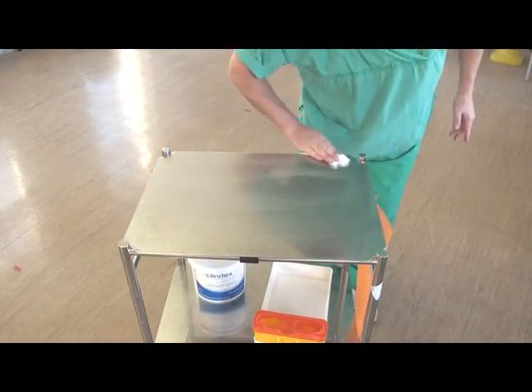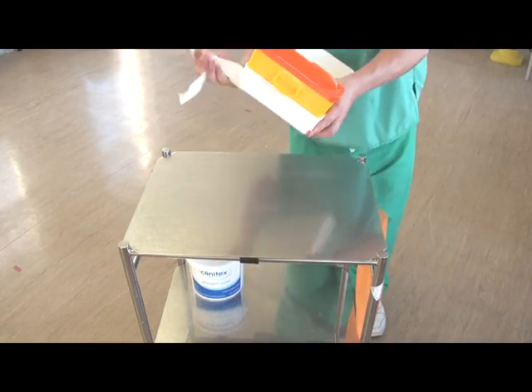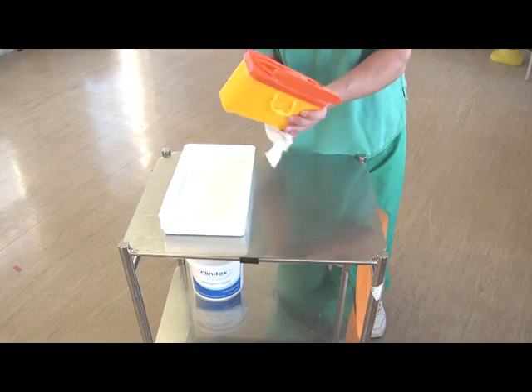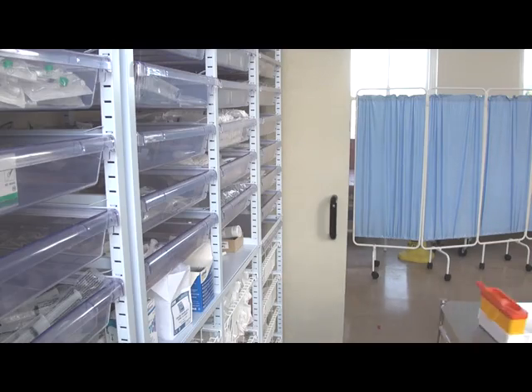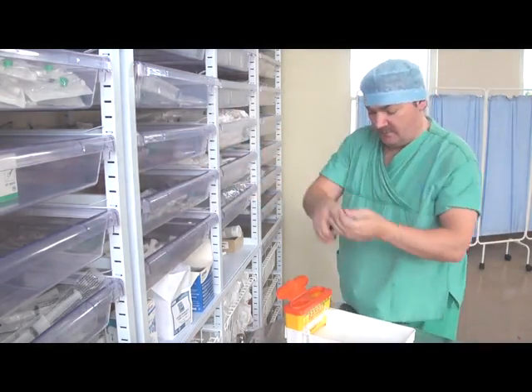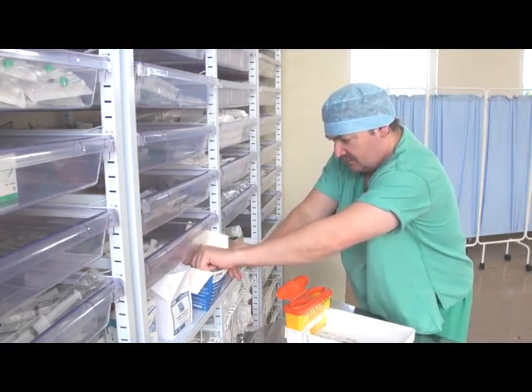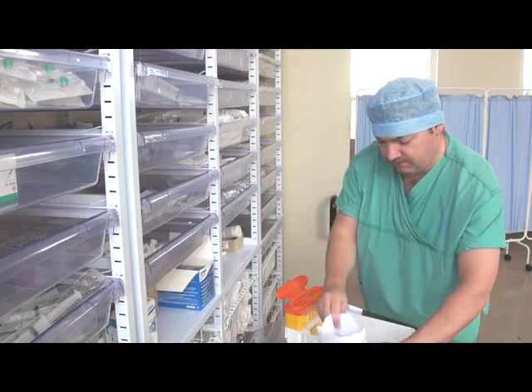Prepare a dressing trolley and ensure all surfaces are clinically clean. Attach a waste disposal bag and ensure the collection tray and sharps box are clinically clean. Assemble all the necessary equipment for the procedure, checking packaging and expiry dates, and assemble the equipment in a tray.